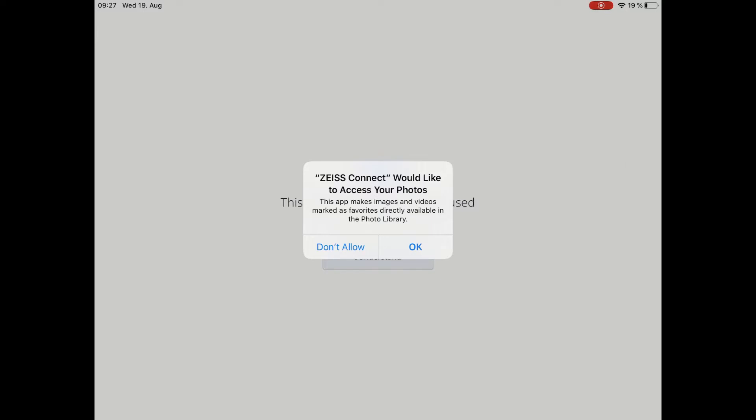ZEISS Connect also asks you to access your photos. When you mark several images and videos as favorite within ZEISS Connect, they will be available directly in the photo library.